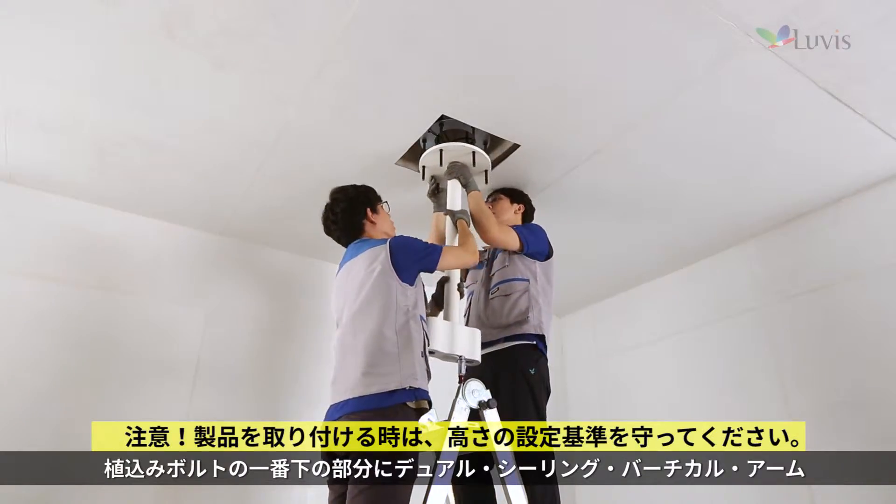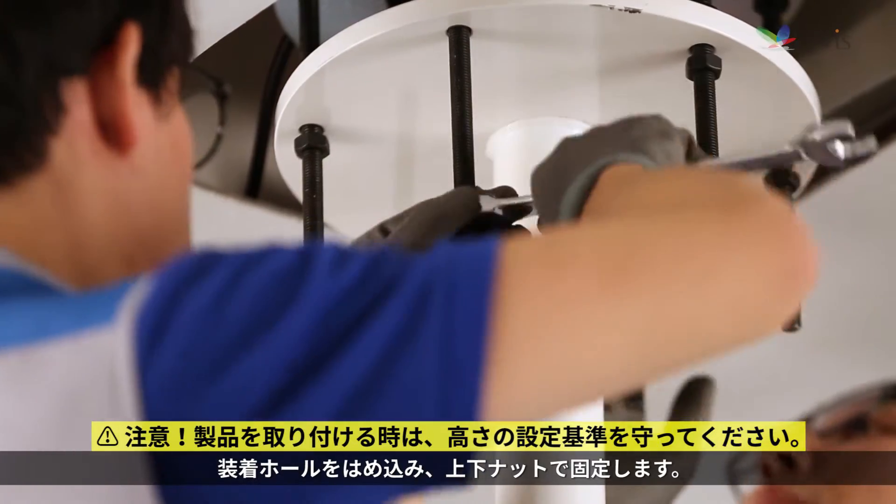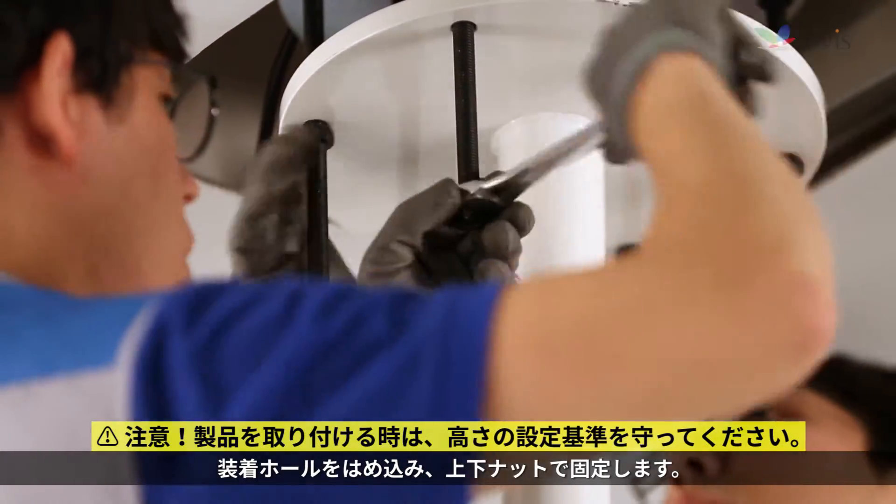After fitting the dual ceiling vertical arm installation hole to the bottom of the stud bolt, fix it with the up-down nut.